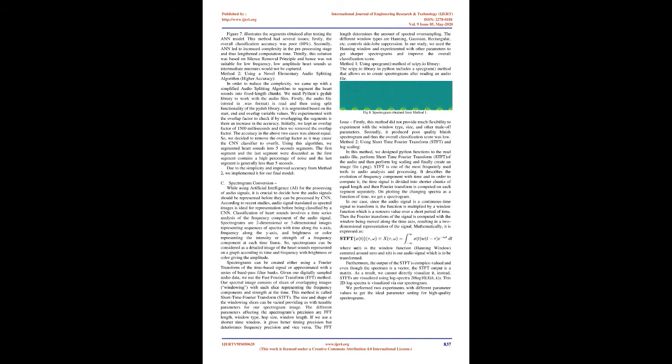We experimented with the overlap factor to check if by overlapping the segments there is an increase in the accuracy. Initially, we kept an overlap factor of 1500 milliseconds and then we removed the overlap factor. The accuracy in the above two cases was almost equal. So, we decided to remove the overlap factor as it may cause the CNN classifier to overfit. Using this algorithm, we segmented heart sounds into 5-second segments.